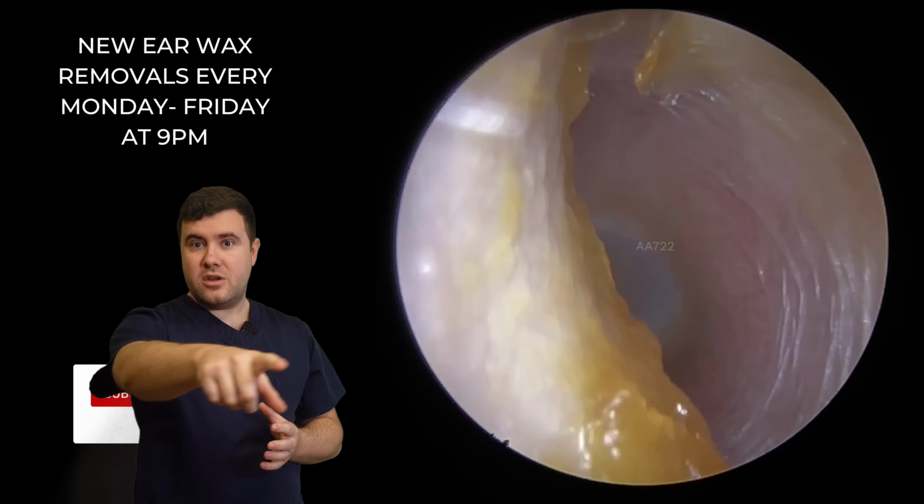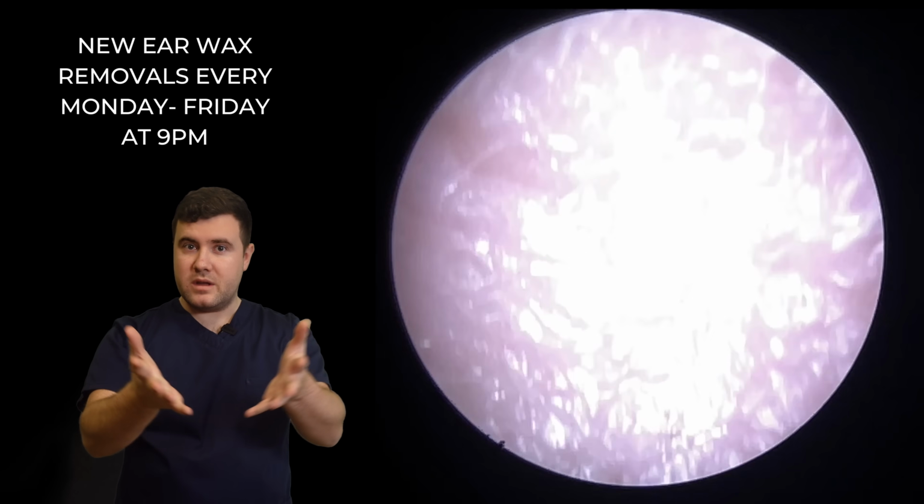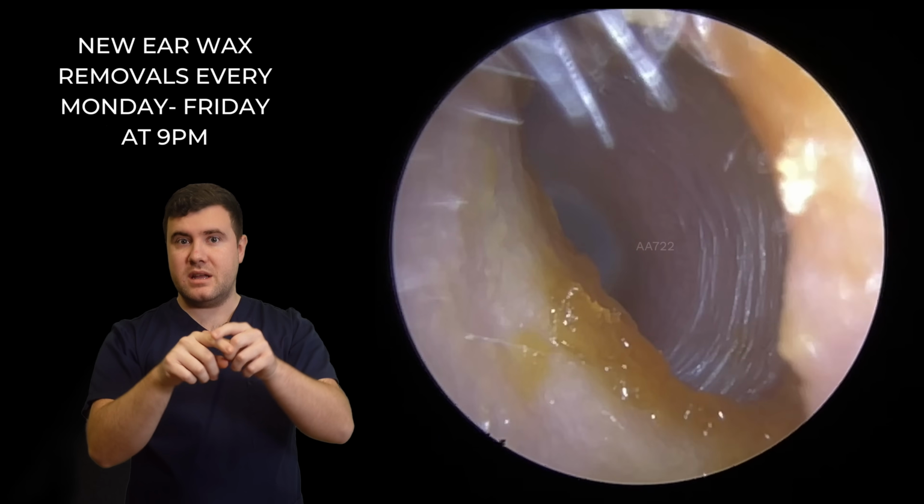So you can see here now, this kind of little ripple on the ear canal. So that's just a layer of dead skin.